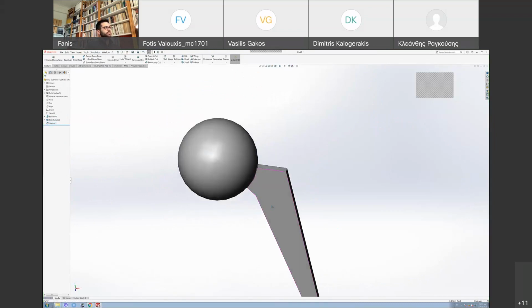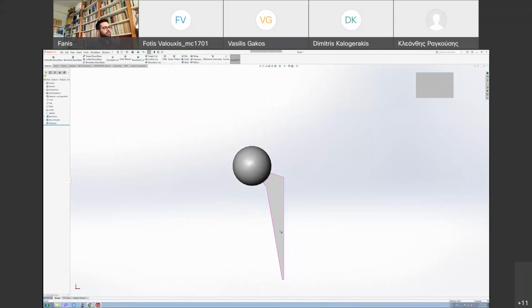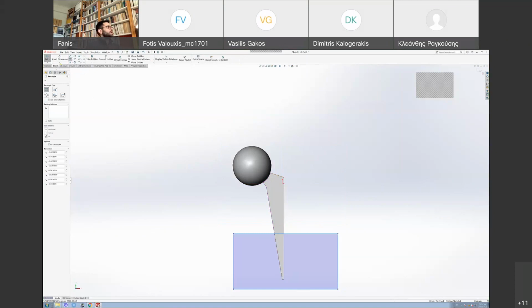Now, in order to mimic a bit the ISO, we're not gonna leave all the stem. The stem is intended to go deep into the femur bone, on the existing femur bone. So we're gonna create again a sketch, plane sketch. Okay, so, and we're gonna cut it at 80 millimeters from the center of the sphere.